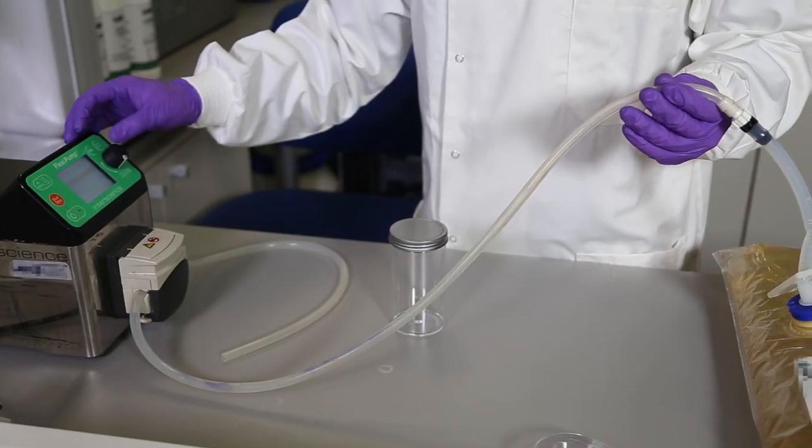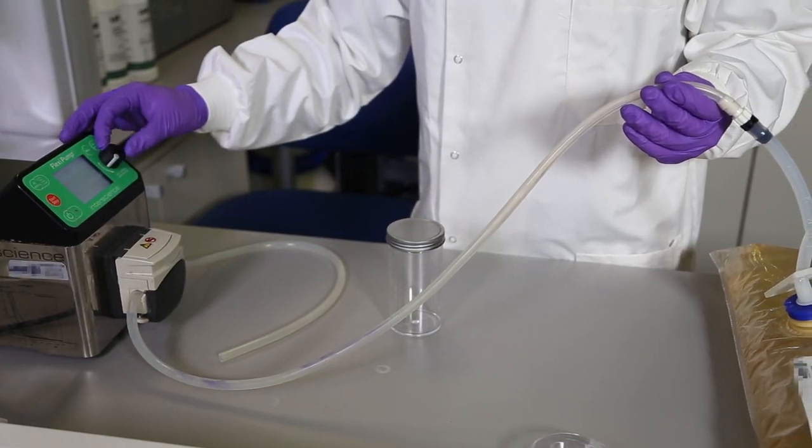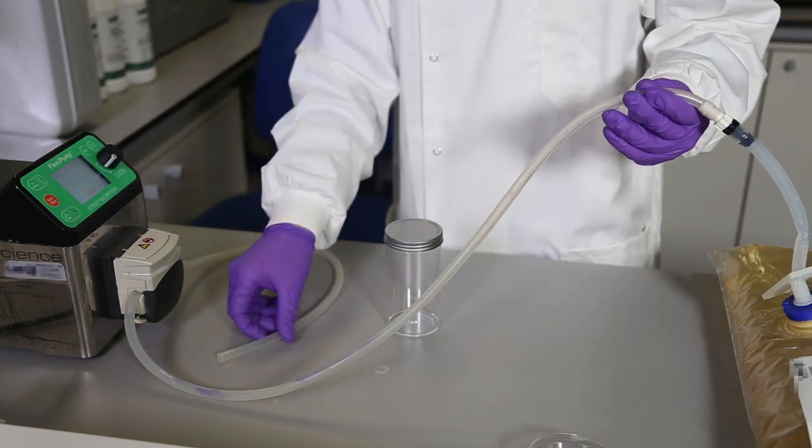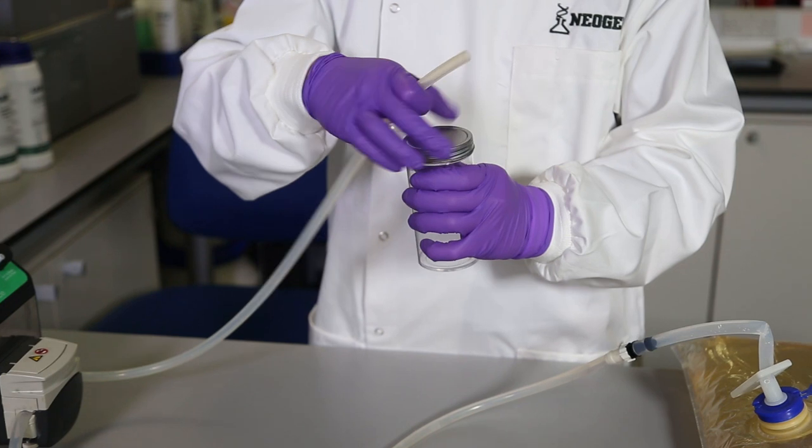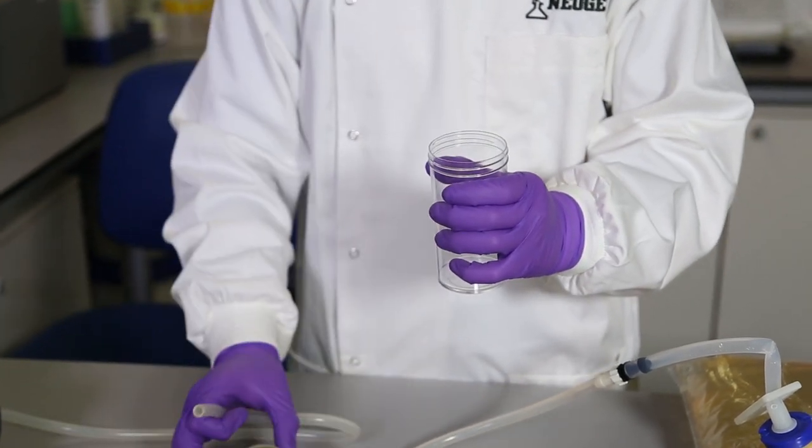Then activate the peristaltic pump, set to pump in the opposite direction from filling, and prime the dispensing line. The bag may now be used to dispense the required volume.